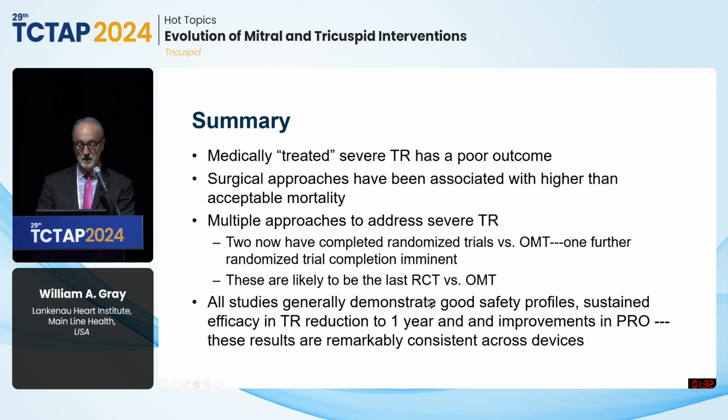And all studies generally demonstrate good safety profiles, sustained efficacy in TR reduction at 1 year, and improvements in patient-reported outcomes. And the results are remarkably consistent across devices.